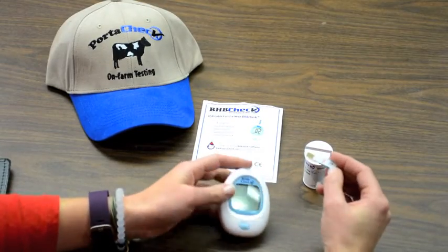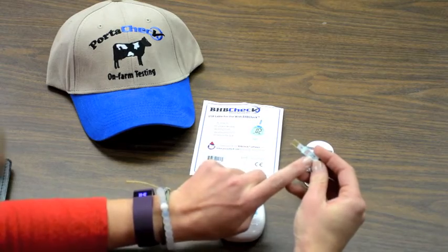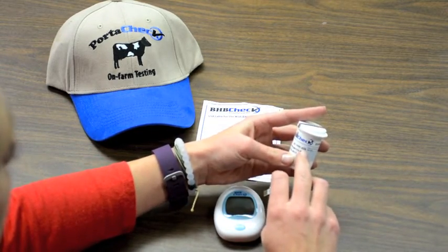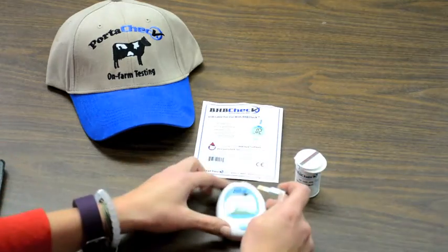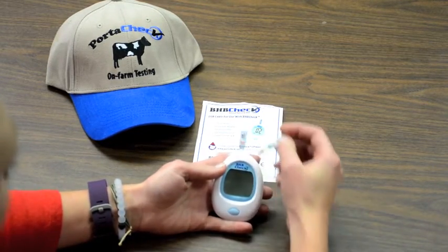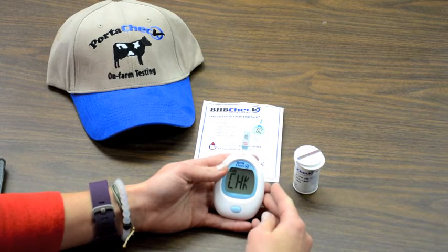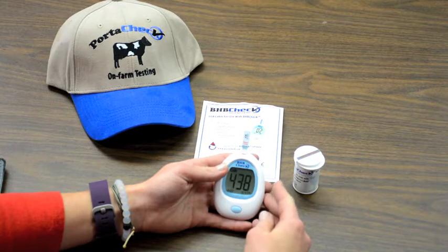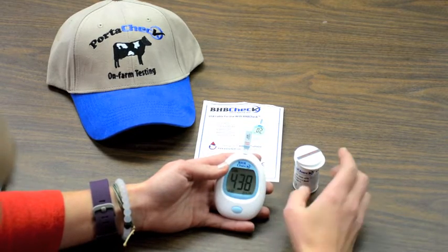This is the calibration strip. On the test strip, you're going to notice a code. This code needs to match the same code that's on the test strip vial. Once you see that the codes match, you are ready to begin calibration. Insert the test strip to turn the meter on. Make sure that the displayed code matches the codes on the test strip and the test strip vial.